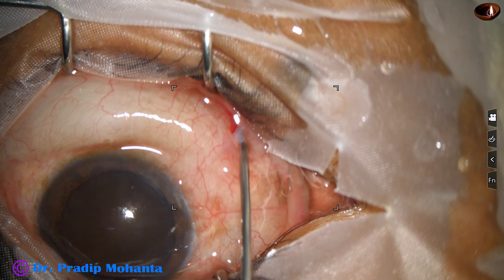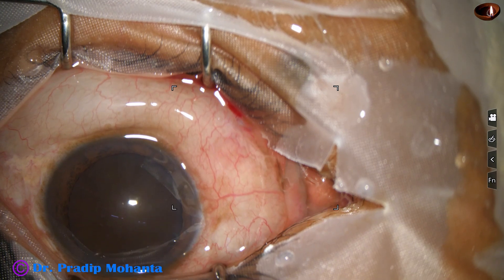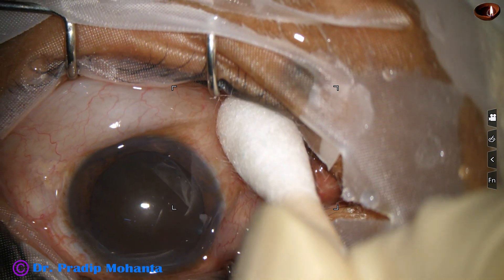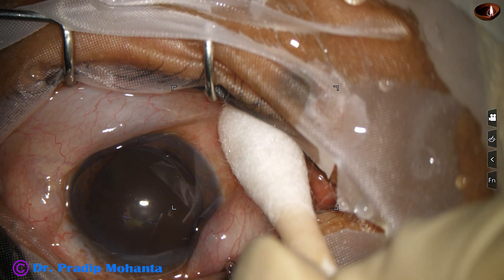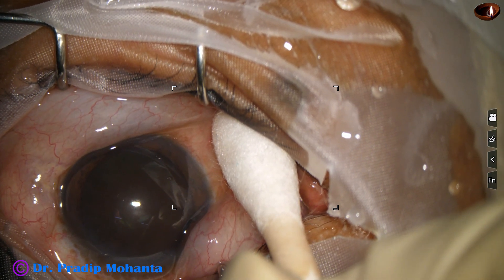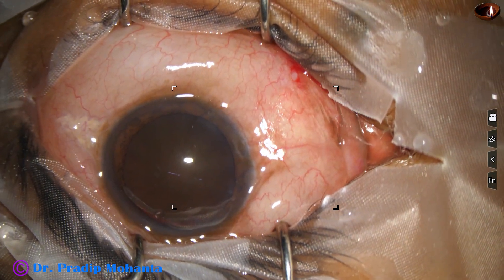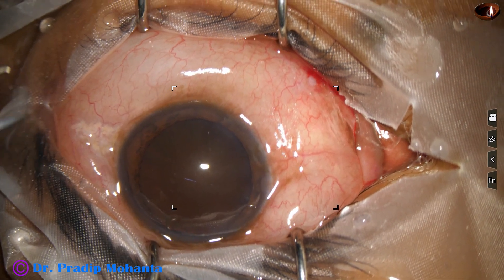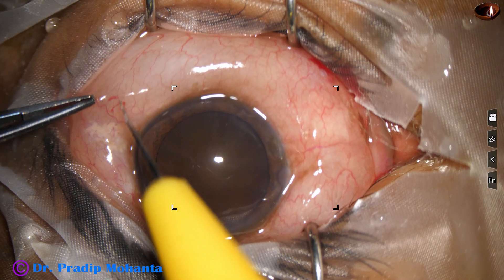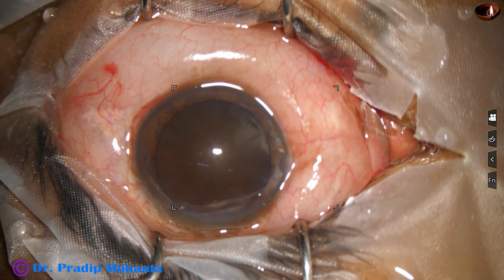The conjunctiva has swollen up. In such cases, we will make a nick in the conjunctiva — you are going to see that in a short time. Keep the eyeball pressed for some time, and then you are making a nick here so that the chemosis decreases.